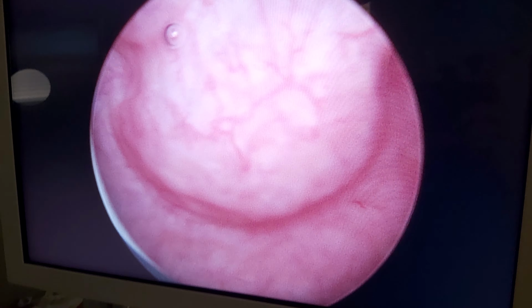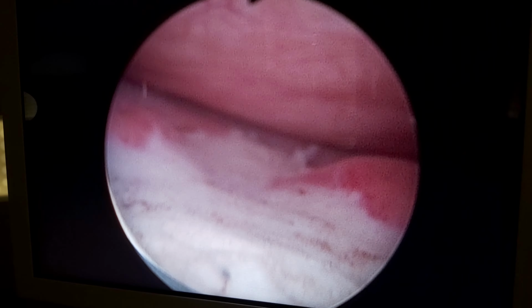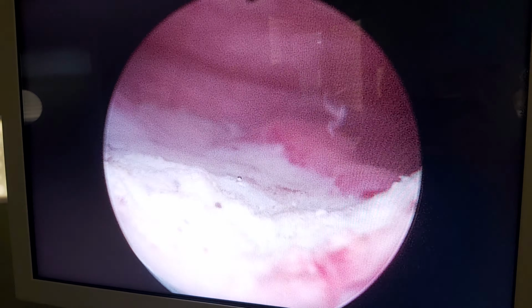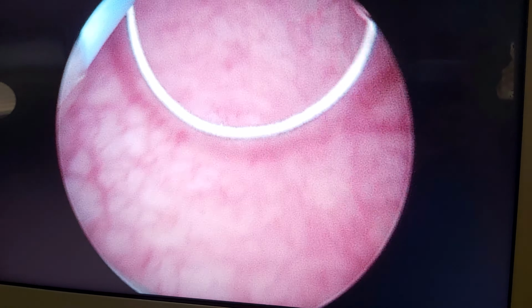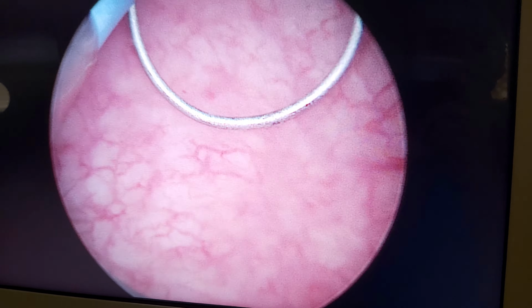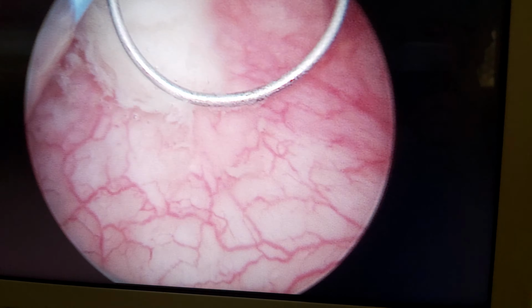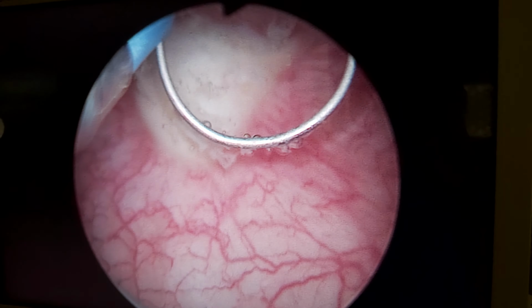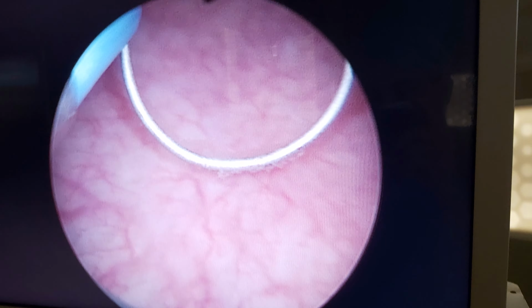So once again, look at this. This is the urethra, and we fulgurated now this part, and I am filling the bladder, and this part is in contact with the trigone. So I want to fulgurate a little portion of this part. When I fulgurate these, new tissues will be formed here, and this new tissue will be healthy. I don't want to take the risk of leaving some infection here.